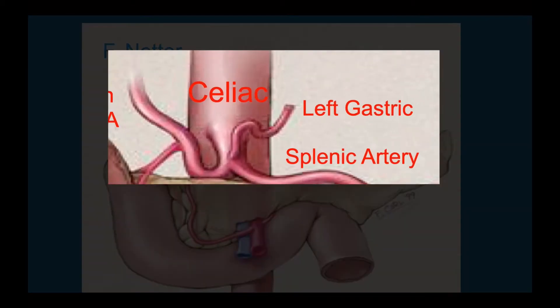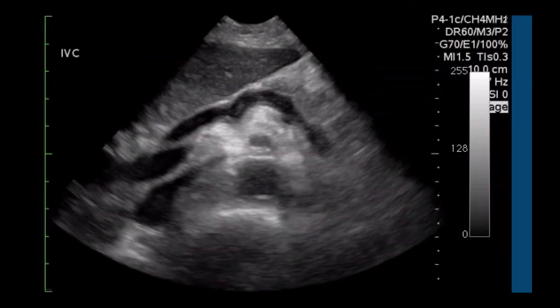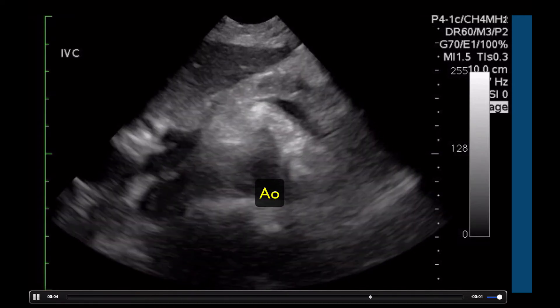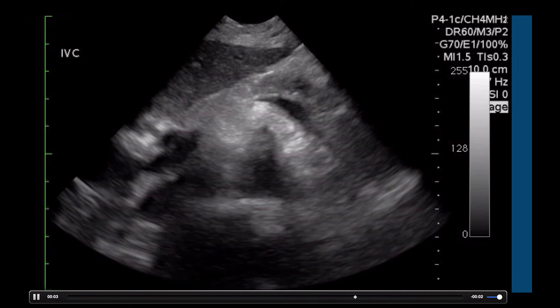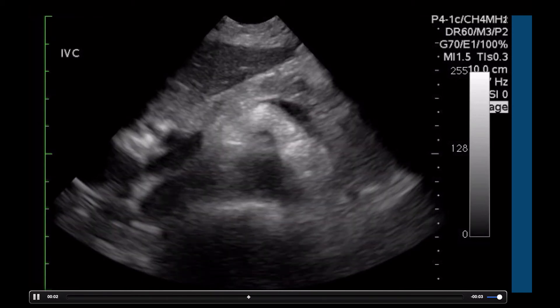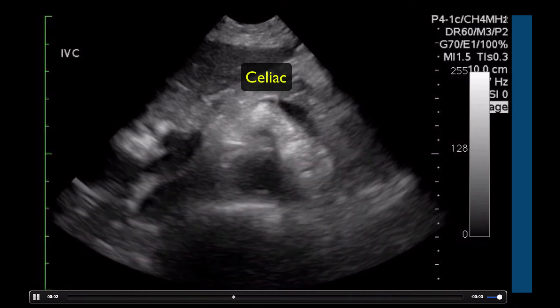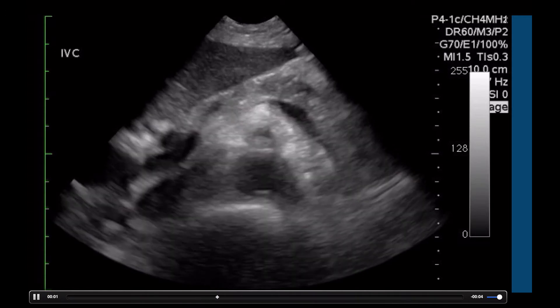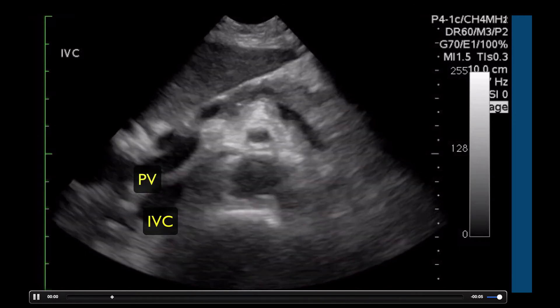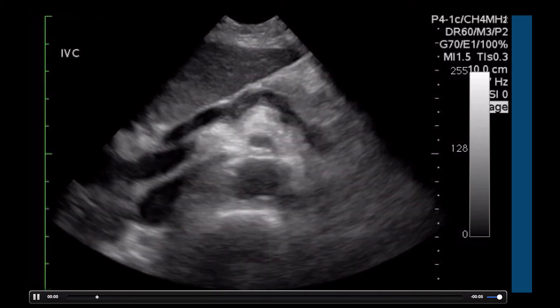The branches of the aorta we look for start with the celiac as the first branch — on the left the splenic artery and on the right the common hepatic artery. Very rarely we may catch a glimpse of the left gastric artery moving superiorly. Above the spine shadow we find the aorta, and above that the SMA — the superior mesenteric artery — surrounded by thick white mesentery. Scanning superiorly, we get a glimpse of the celiac axis, which looks like a seagull, showing the common hepatic and splenic arteries. Right next to the aorta we see the inferior vena cava, and just above that the portal confluence.